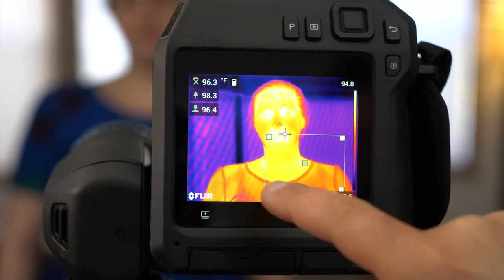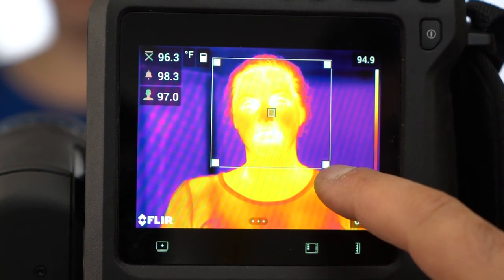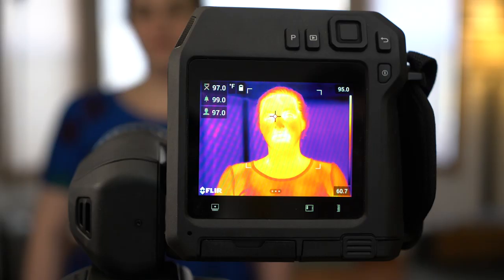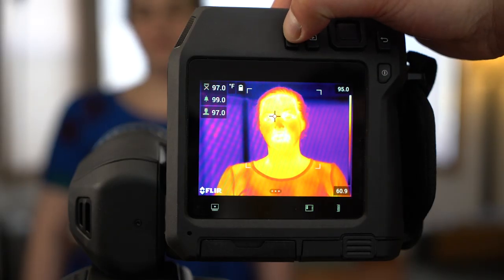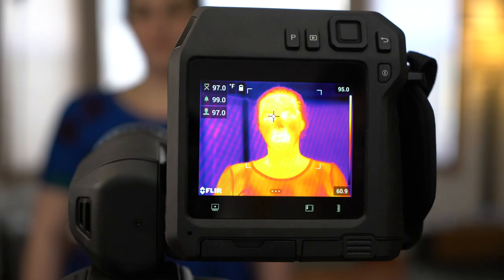We'll set our baseline using a person whose body temperature is within normal range, placing the area of interest over our subject. Press the P button to set the baseline. The camera has now been set to alert us when it detects a temperature over two degrees higher than the baseline.